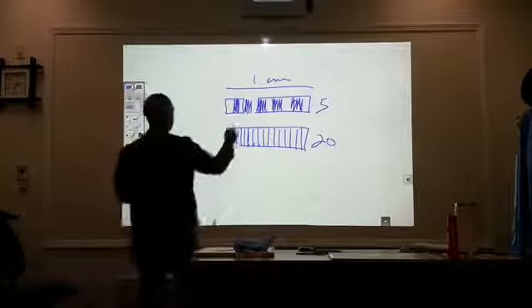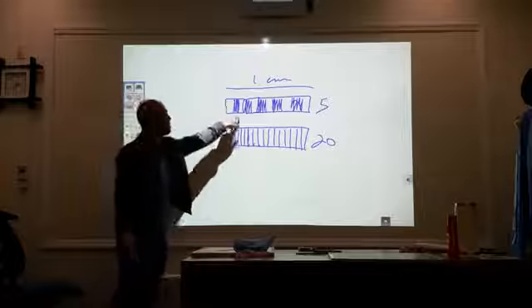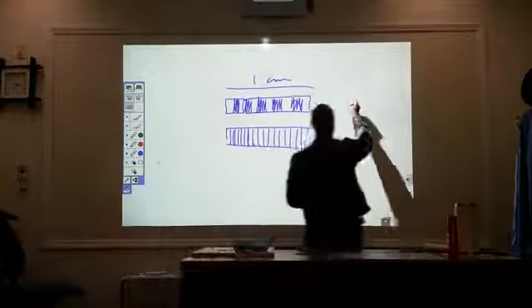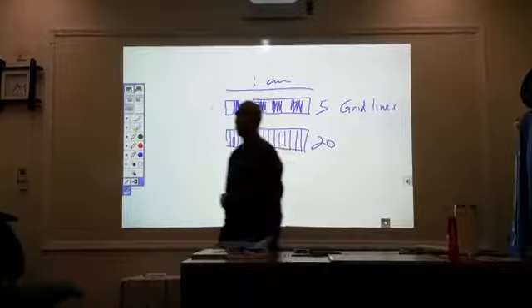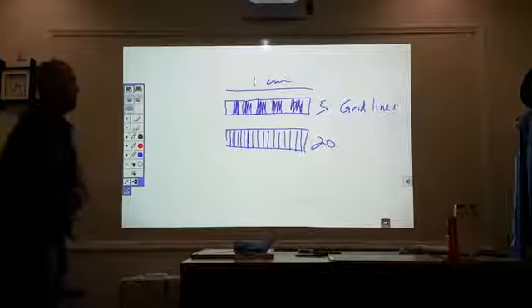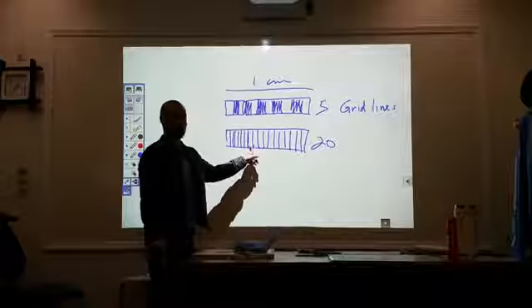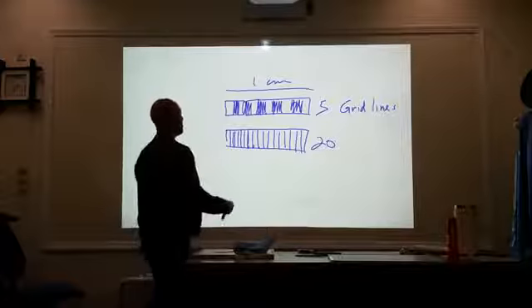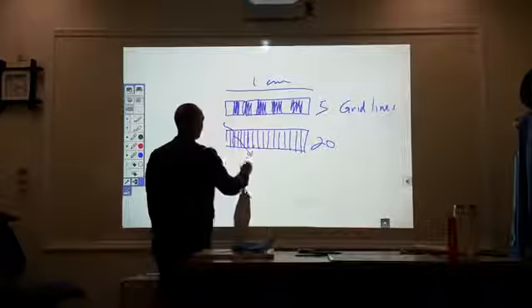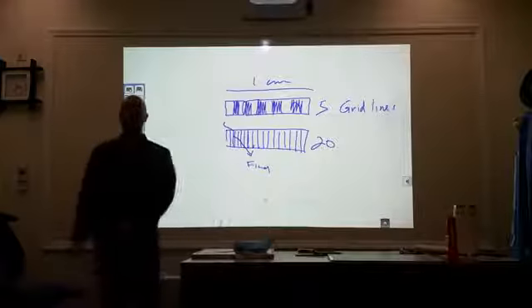Which of the two is better? If it's too thick, because the strips are thicker, what are you going to end up with on your radiograph? Thick lines. Grid lines. You're going to see the physical manifestation of the lead strips on your radiograph. Now, are we going to see grid lines with thinner strips? No. You guys agree? No, because they're thinner, right? But because they're thinner, what's going to happen with the stronger energy scatter radiation? It's just going to go right through it. So there is greater chance of penetrating those strips.